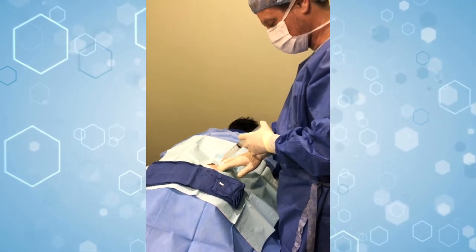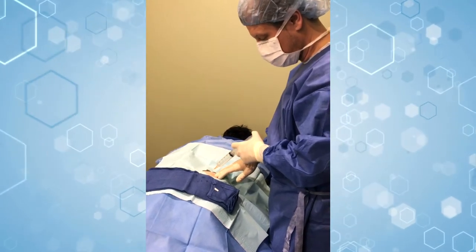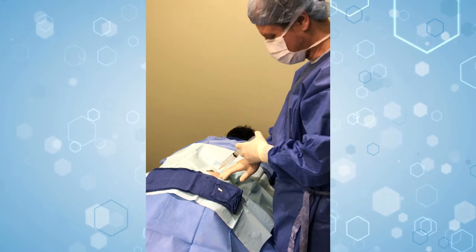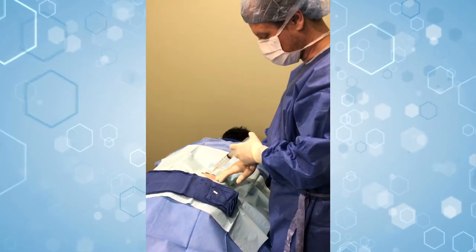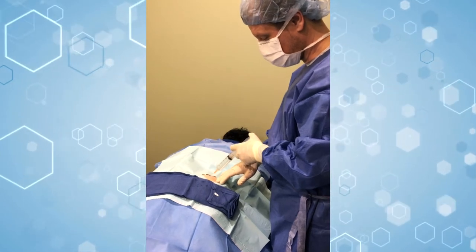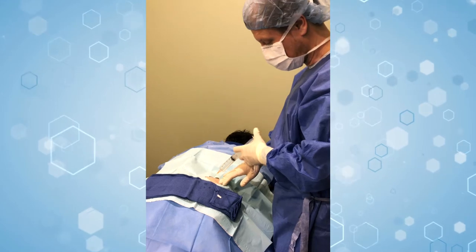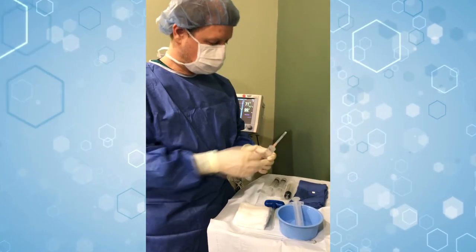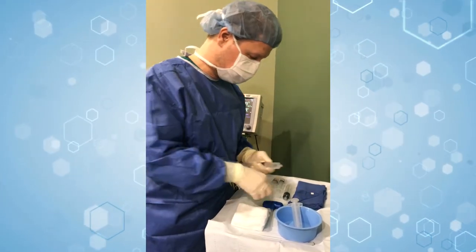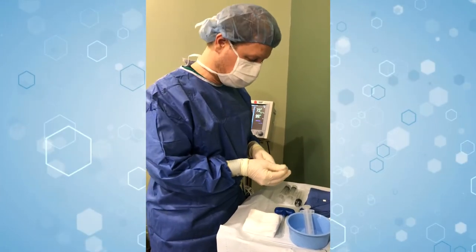Where most people feel pain is going to be at the surface of the skin — that's known to most people; if you cut yourself, it hurts. And then also at the level of the bone we're going to go through, the periosteum has a lot of innervation as well. So we want to make sure we put a lot of numbing medicine around that area. We'll use that small needle first to make sure everything is numbed up comfortably, and then we'll switch out to a little bit larger one. It just makes it easier and allows us to really put the numbing medicine down into that periosteal layer.